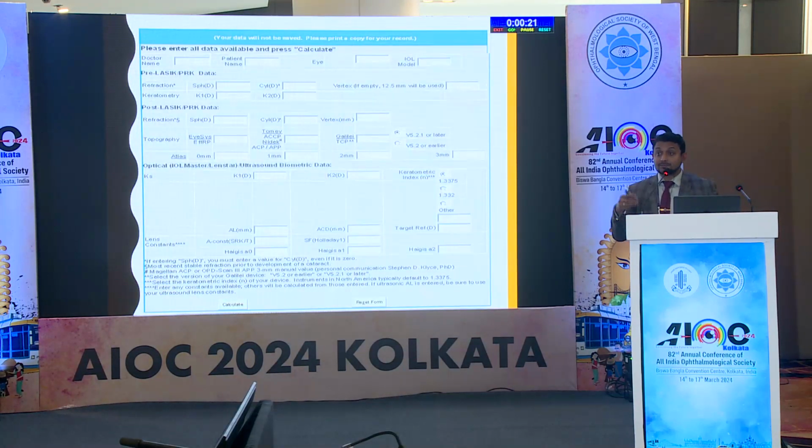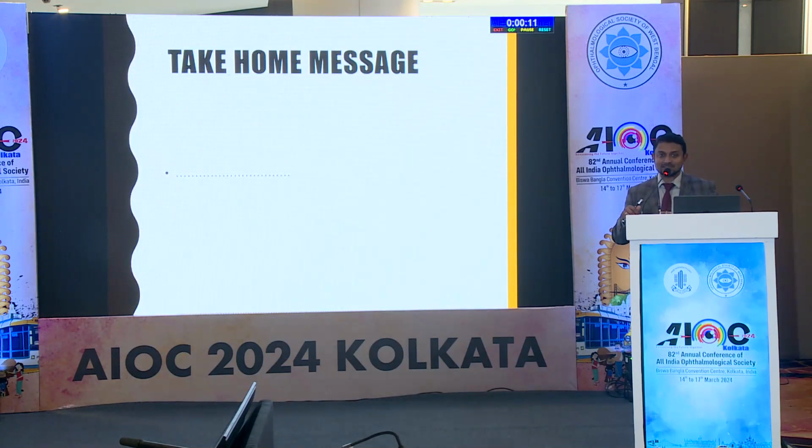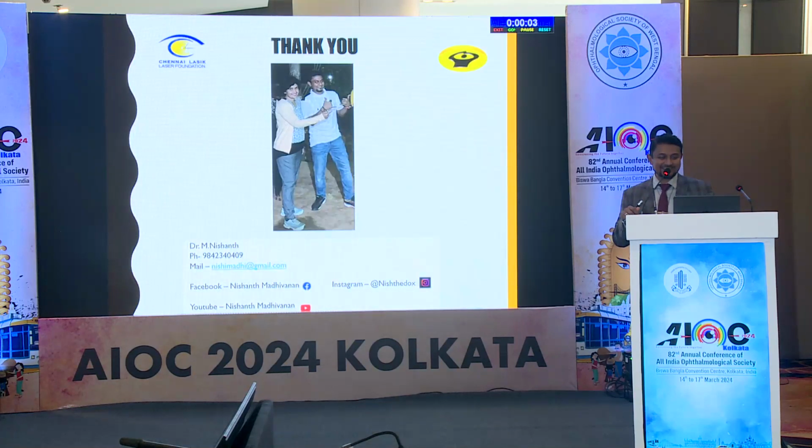And you have these post-refractive cases, which you cannot do in SICS and plan a monovision. So post-refractive cases you should definitely take care of in the ASCRS calculator. And what is my take-home message? I think there is no other take-home message. There's only one message: do phaco and then try to do a monovision, and not SICS.